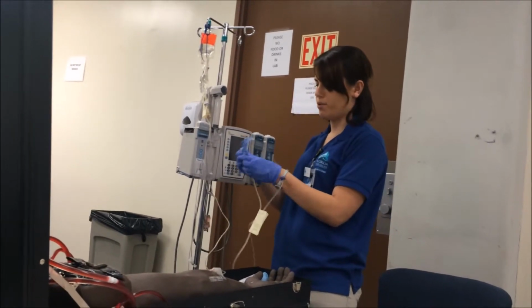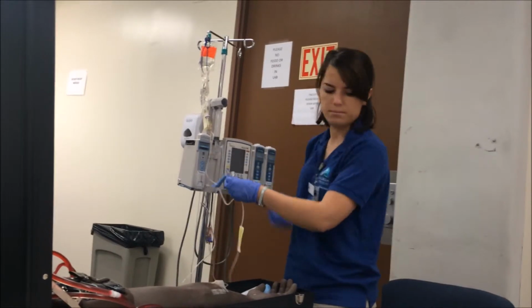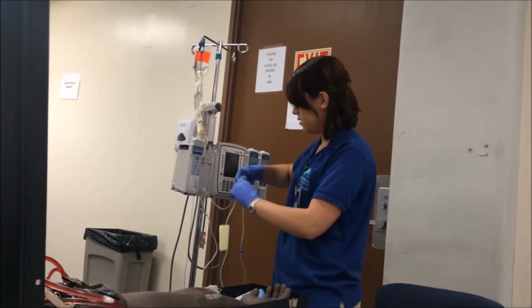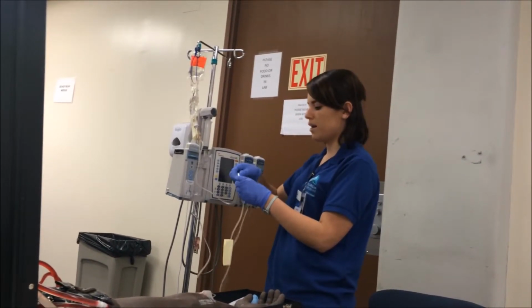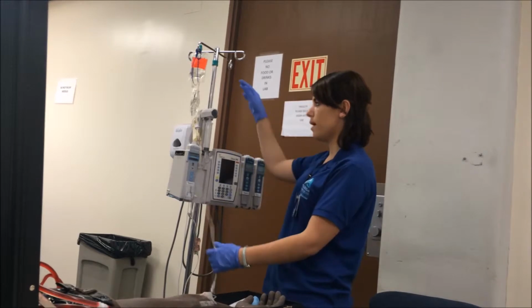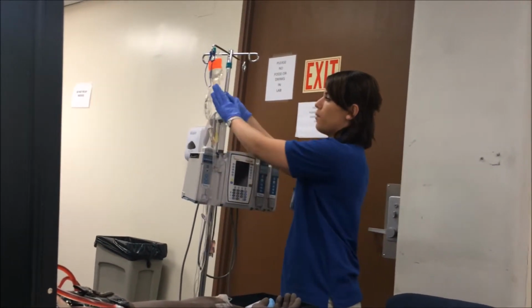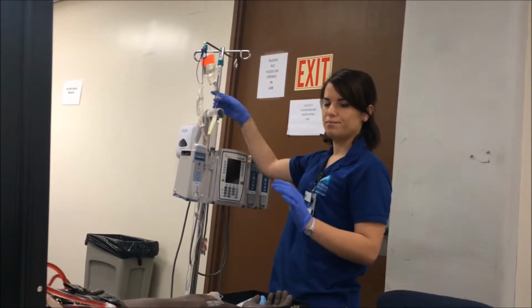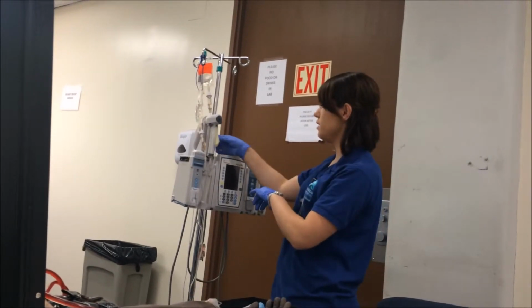Make sure I clean my port. Make sure this is cleaned as well. And I'll go right ahead. And so everything else is clamped in the primary, so I'm going to go ahead and unclamp my piggyback so just the piggyback medication can run. Of course, I forgot to mention, I will also insert fluid into my chamber. And at this time, I'm going to go ahead and establish my flow rate.